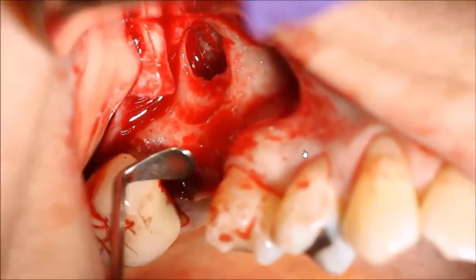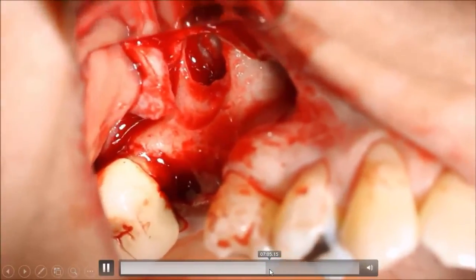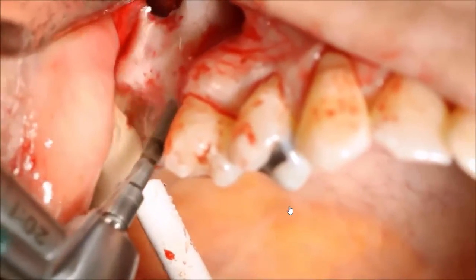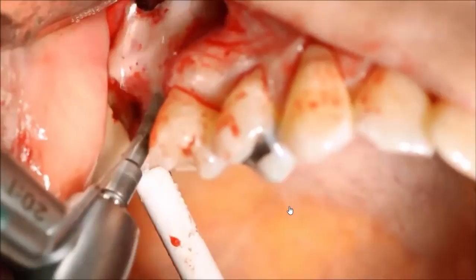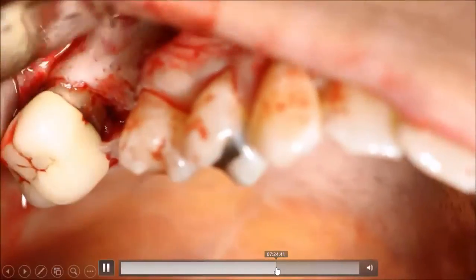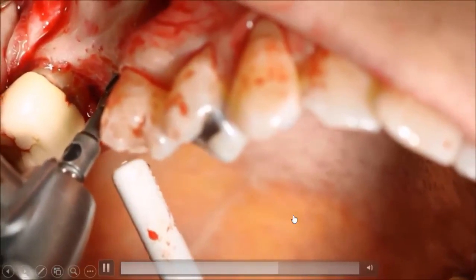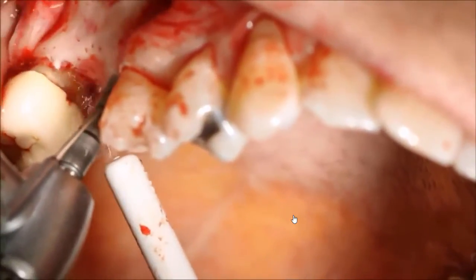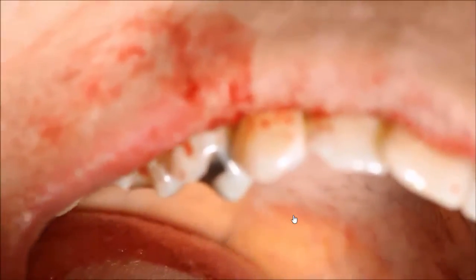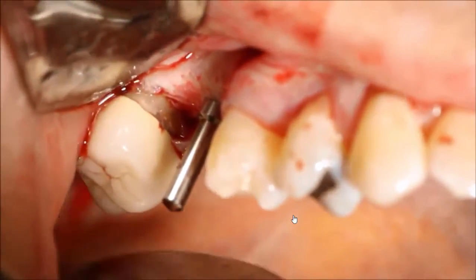وهلا الخطوة الثانية حتكون ال osteotomy preparation for implant placement. هون بلشنا بال preparation for the osteotomy. طبعا دائما حنفضل لما نعمل immediate implant with external sinus lift إنه نخلي ال osteotomy diameter smaller than the implant diameter, like about half a millimeter, to get good stability.